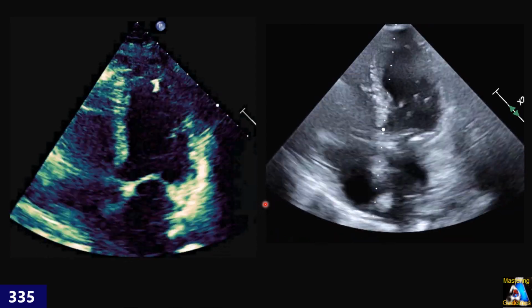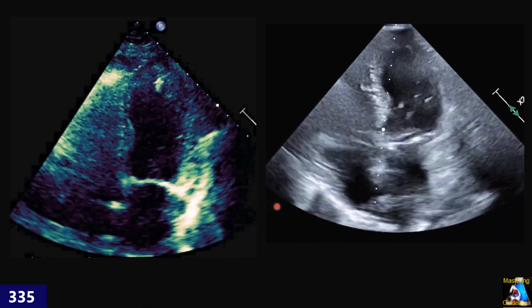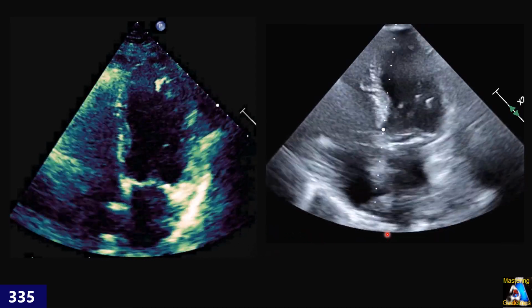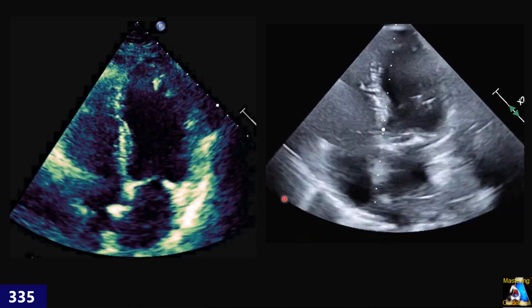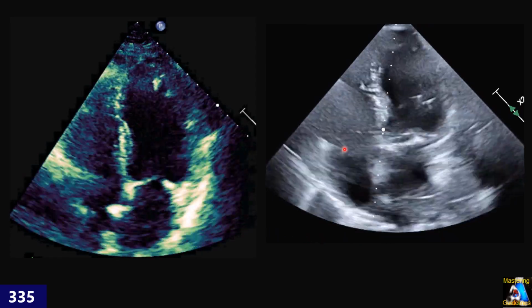The patient is on a ventilator, or post-op, or has severe COPD, and we don't have a parasternal window and not subcostal either. So we get this apical, that is the best imaging. We have the best view for apical. We can evaluate LV function, aorta, Doppler, mitral valve, but not the others.